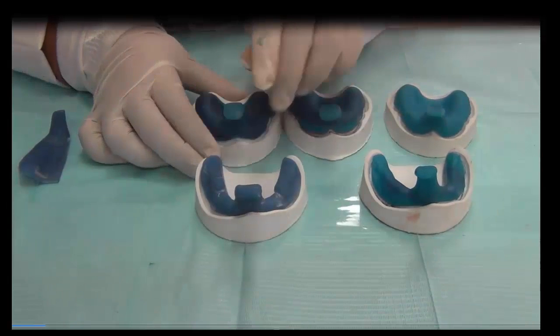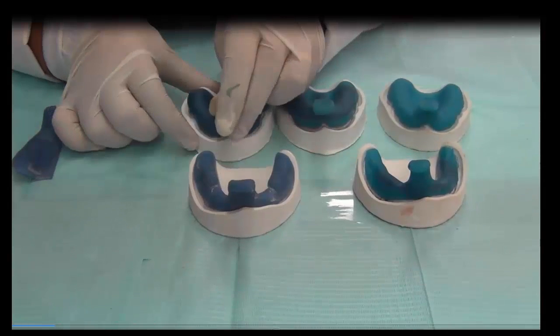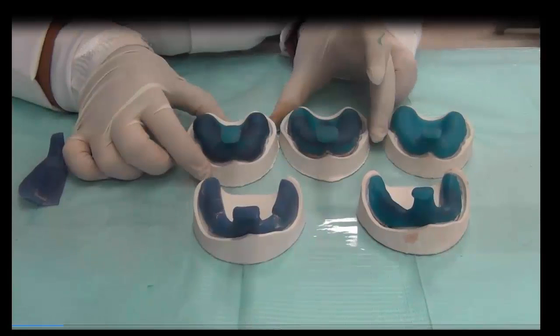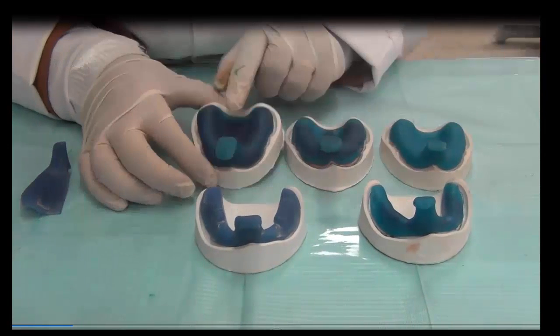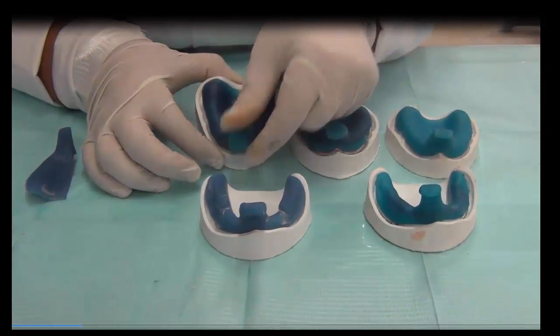So we need to do what we call custom tray. This custom tray is fabricated over this cast. That means this tray fits this patient only. And the trays come in multiple shapes, but looking at them in general, we have what we call the body of the tray and the handle.